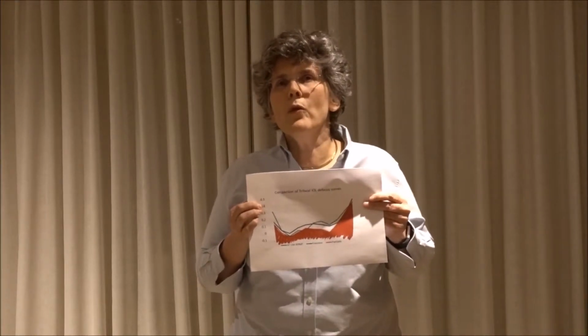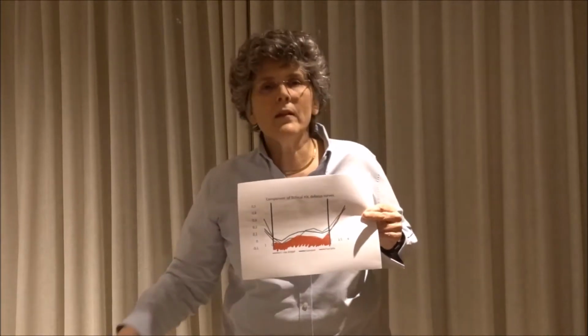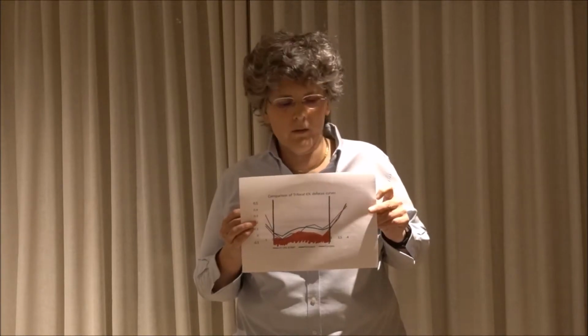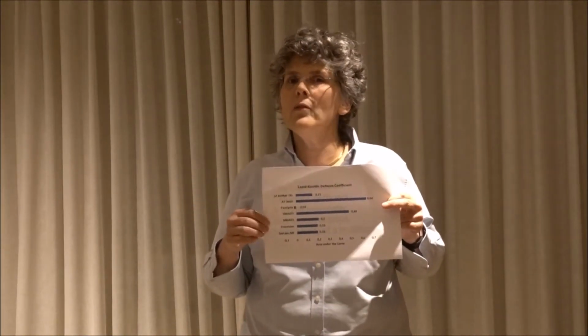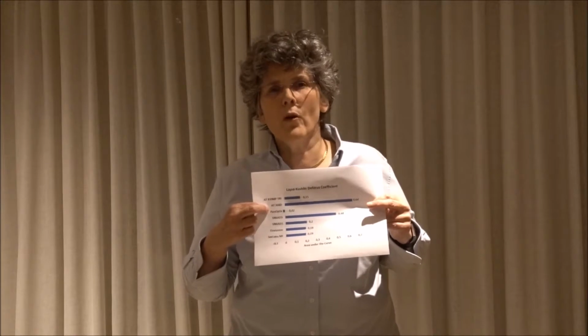So we want to limit the defocus range that is being used in order not to get a deranged defocus curve coefficient. In short, we limited it to 0 to -3 or +1/2 to -3 diopters, and then we calculated the area under the graph. And we did this for several types of lenses. And as you can see here, with all these lenses that we tried out on the defocus curves, the newest trifocal IOL, the Panoptix, comes out with a negative defocus coefficient.